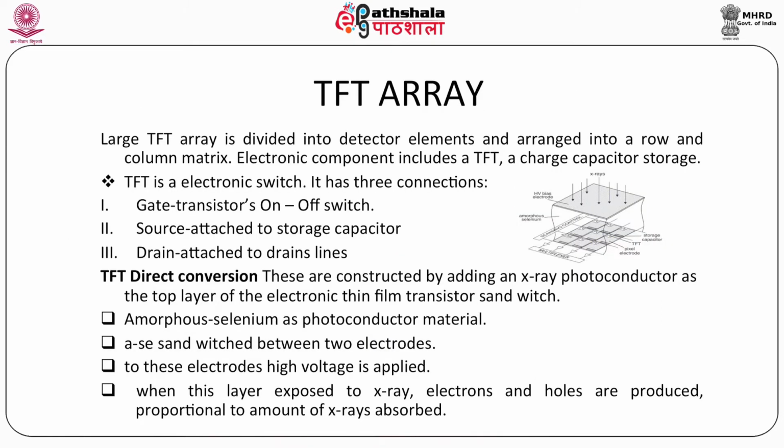Now, how are these trapped electrons converted, that means, how is the latent image converted into a digital image? It has mechanical features, optical features, and computer control with those features, as in the scanner IP, as shown in the figure.